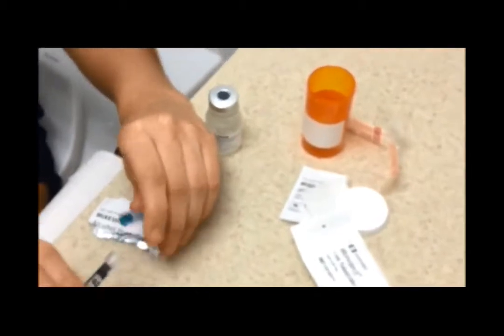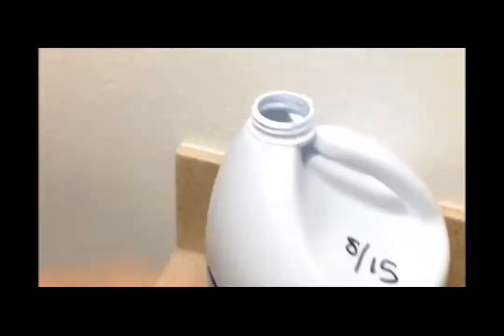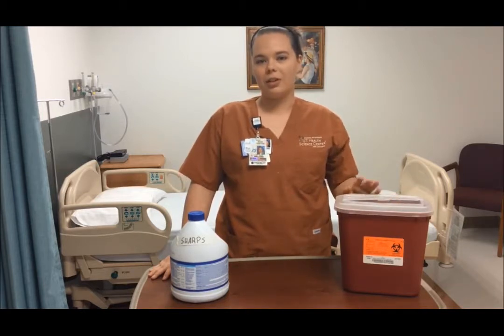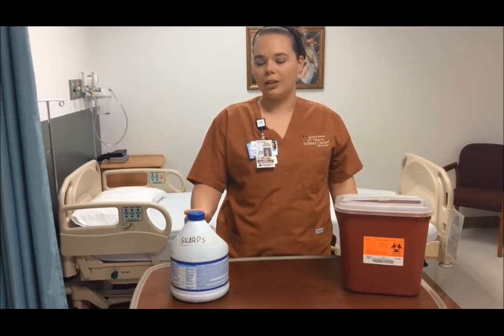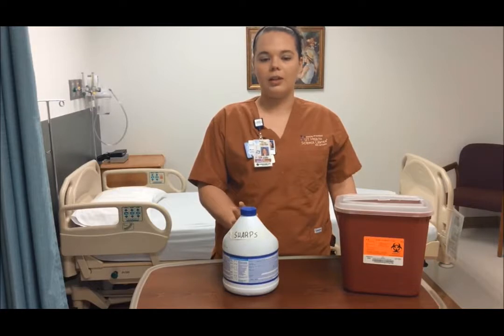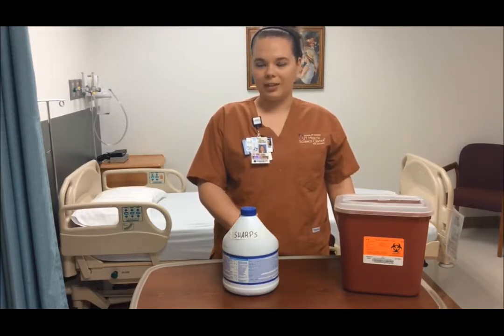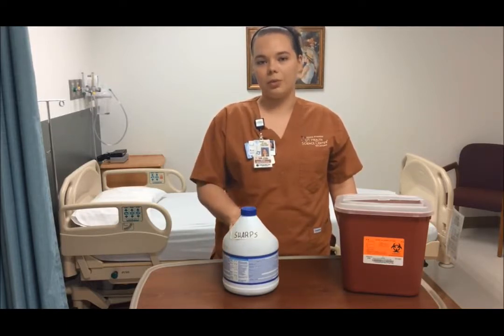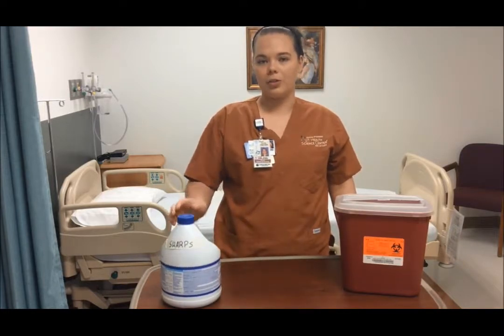You will need to immediately dispose of your used needle into your sharps container after you have injected it. There are two options for disposing of your used sharps. The first one we recommend, and it involves buying one of the mail-in services that you can get from your local pharmacy or online through multiple services. The second option is outlined by the Texas Commission on Environmental Quality, and all the requirements say is that you dispose of your sharps in a thick, non-see-through plastic container, and that it is clearly labeled sharps and duct taped shut at the time of disposal. And then you can throw it away in your regular garbage.